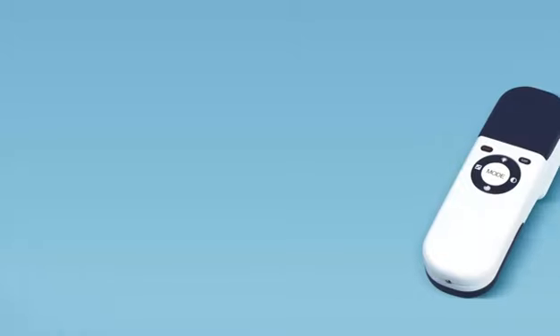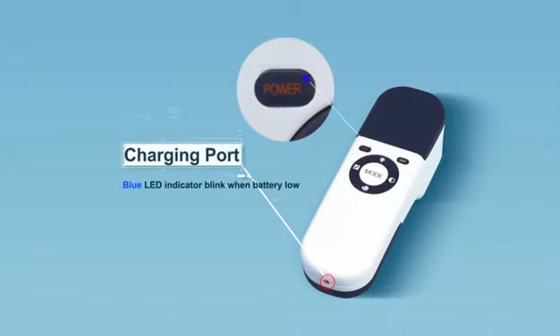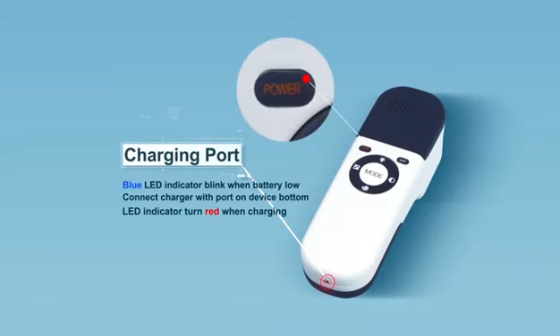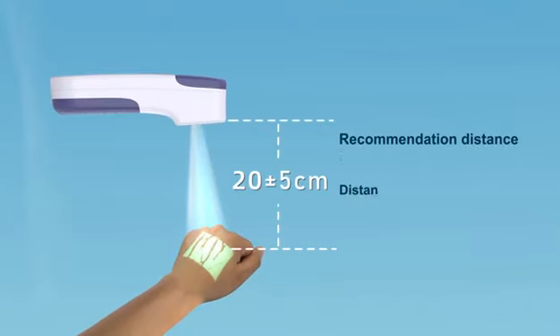Blue LED indicator on power button will blink when battery is low. To charge VeinFinder, connect the charger with AC power and insert the charging cable into the bottom port of the device. The indicator turns red during charging. When battery is fully charged, the indicator turns green.